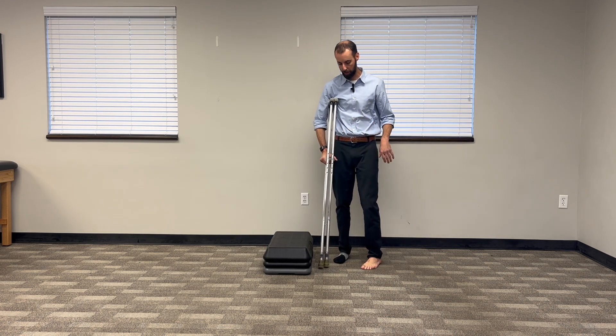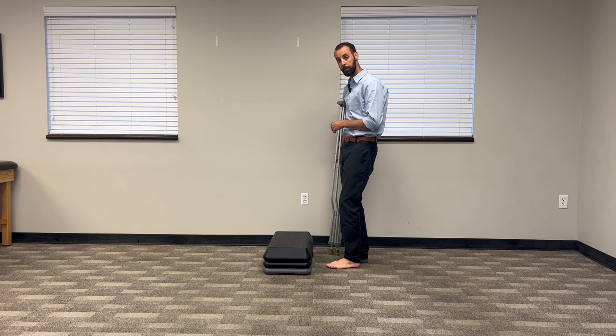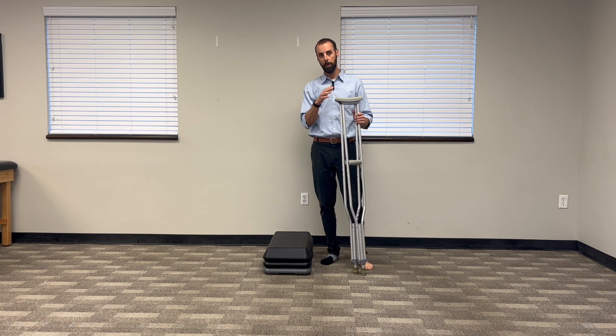You go up with the good foot just like that. If you can hold them both in one hand, do it that way. Keep them on the opposite side. If you need to use one, just carry the other. And if you are in your home, you can even get multiple sets for upstairs and downstairs and use them that way. So that's how you go up.